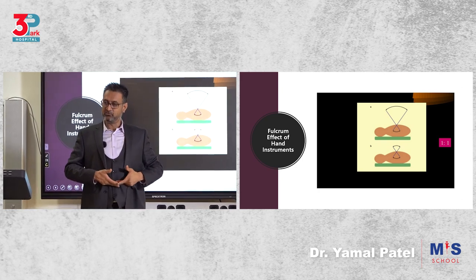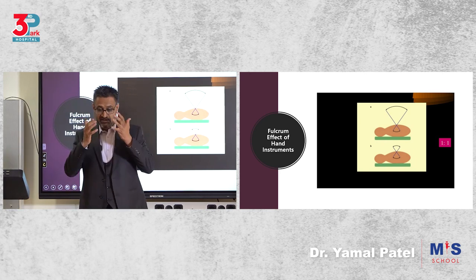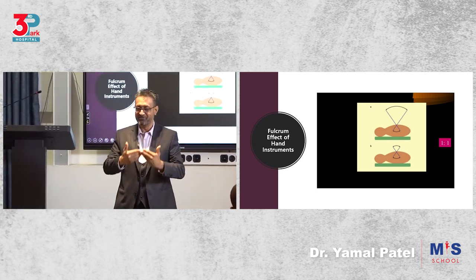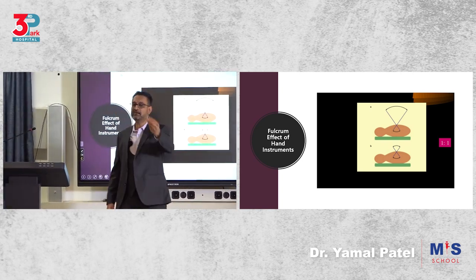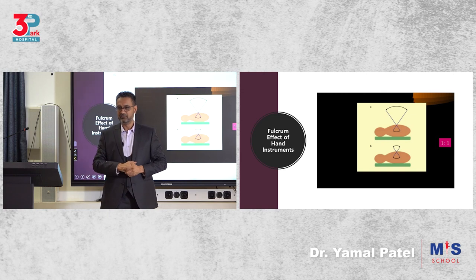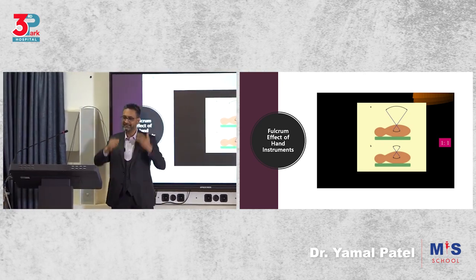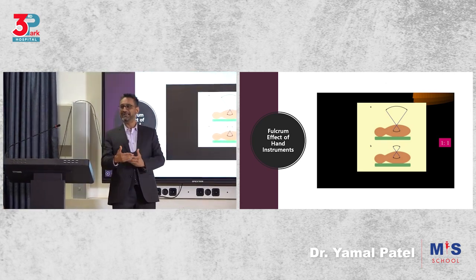Okay? If the uterus is up to the umbilicus or just below the umbilicus, you can't put a port in the umbilicus now. You'll be sitting and watching the uterus like this, and you'll be wondering, how am I supposed to navigate this? So what do you do? You move your scope away, go higher, and then you'll see the pathology there. It automatically looks less threatening to you. You'll be like, it's okay, that uterus I can handle. So don't work with the uterus this way. You've understood what I'm saying? Keep it far. So change your positioning based on that. There is no standard positioning. You have guidelines, but based on pathology, you might change.